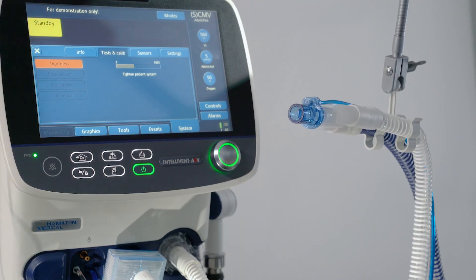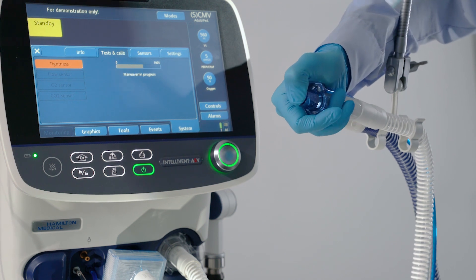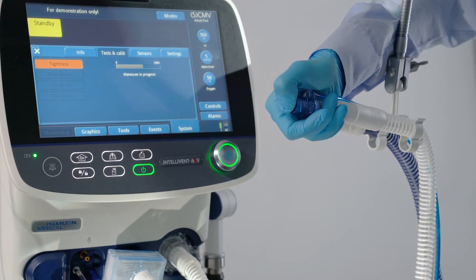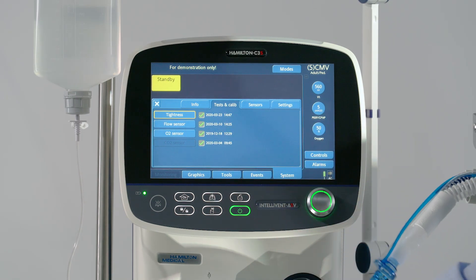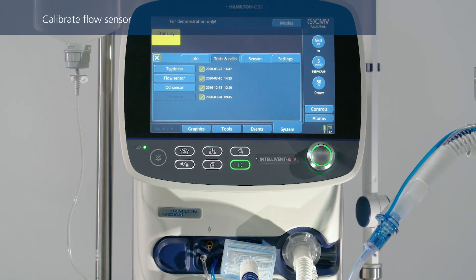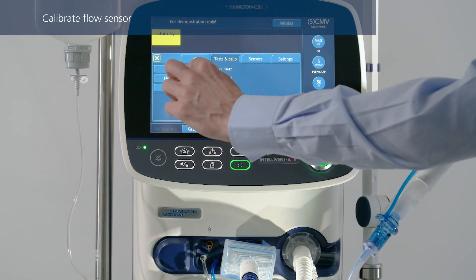Perform a tightness test and flow sensor calibration each time you have connected a new breathing circuit or component, including a flow sensor. The tightness test checks for leakage in the patient breathing circuit. To perform the tightness test, select the desired operation, then follow the instructions from the ventilator. Please note that wearing a glove is recommended.